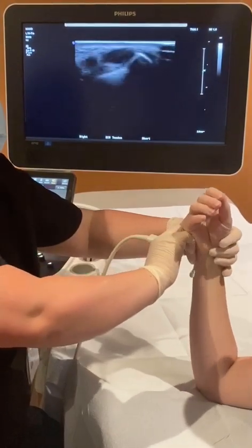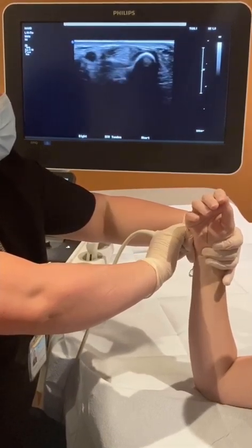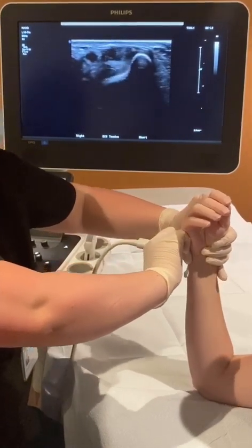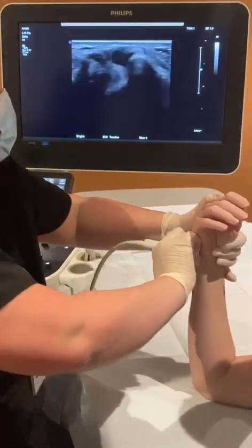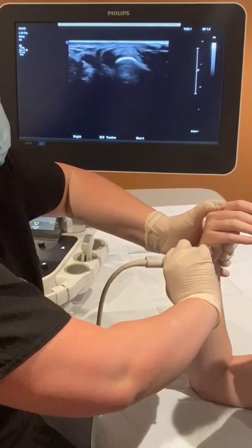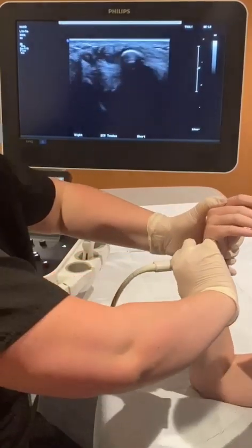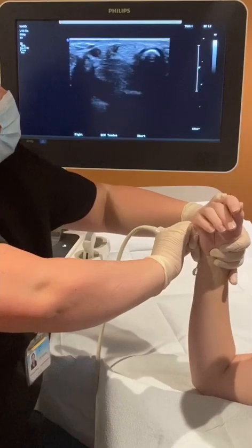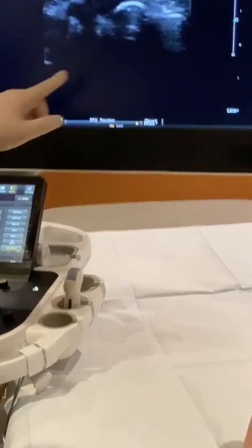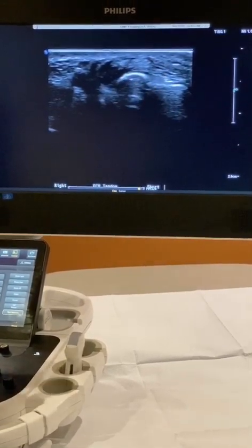Sometimes you have to keep at it just to do it as well as possible. You can actually see that the tendon did dislocate over the ECU, but we want to get a better demonstration of that. So this time I'm going to supinate her wrist and go back and forth — sometimes it takes a couple of times to get your groove going. Keep going back and forth until you get a really good example. You can see now that the ulna is here and the ECU tendon did dislocate over the ulna on this side.